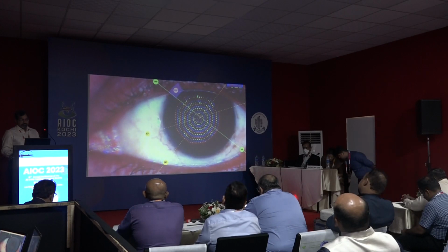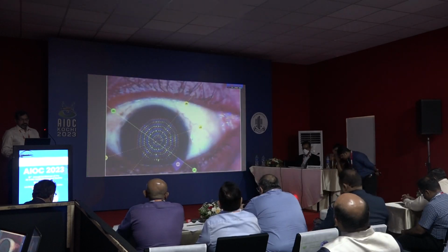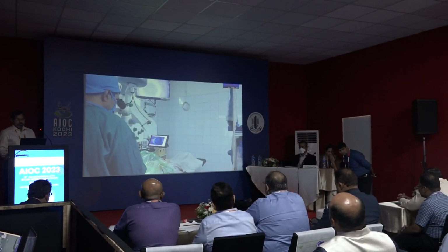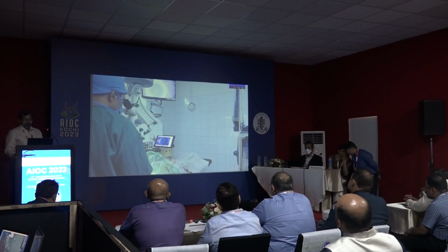Identify 2 prominent limbal structures. Click on it. The system will display their axis. It is 17 and 50 degrees in this case. Save the picture, rotate it as needed, and use it intraoperatively to identify landmark points under microscope.